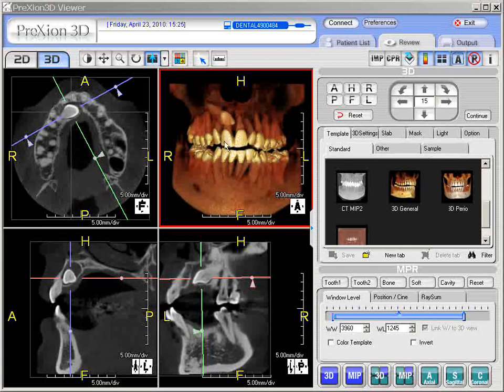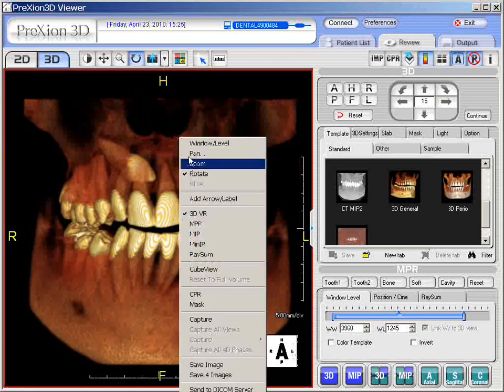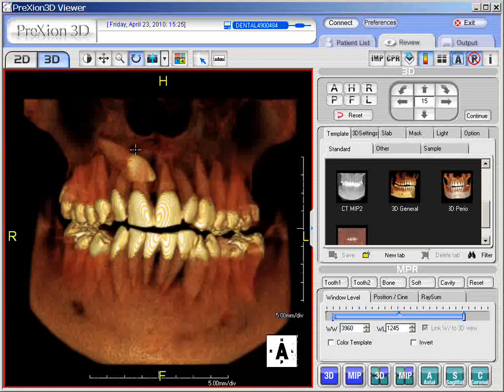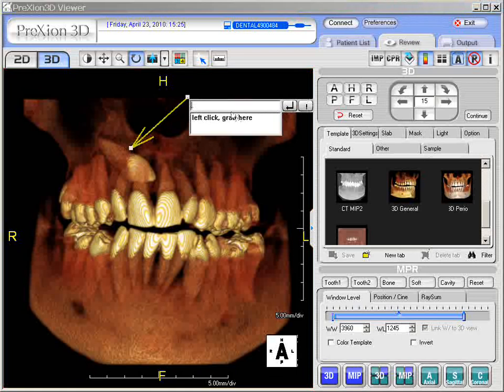One may just wish to add simply an arrow. We can double-click in the 3D image, and to add an arrow we can right-click on the mouse. About a third of the way down you'll see a function for 'Add Arrow Label.' Once you left-click it, the caliper becomes the point of the head. Left-click it, drag it, and release it to an area that's up and away so when you write it doesn't come across on any of the anatomy you wish to look at.